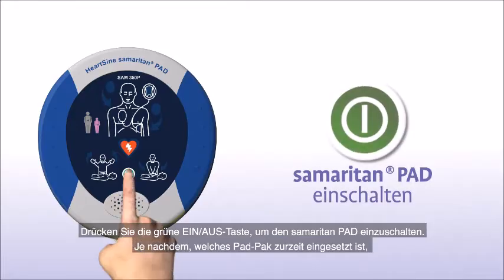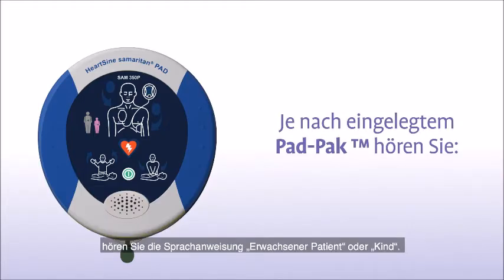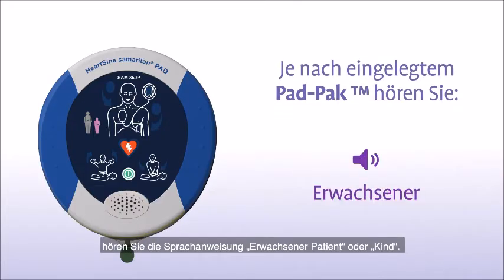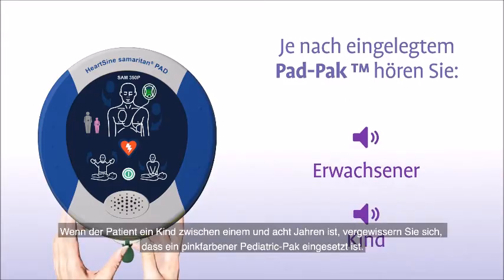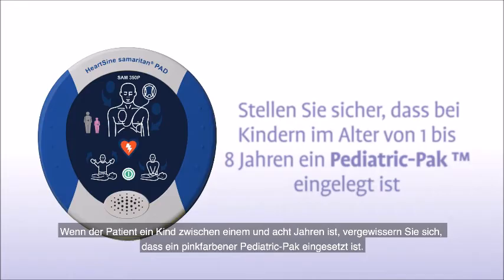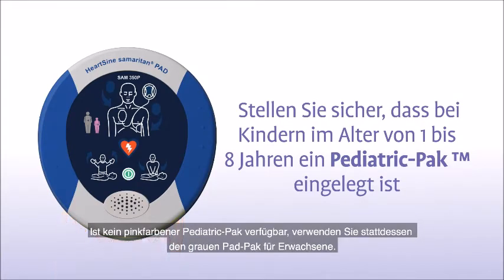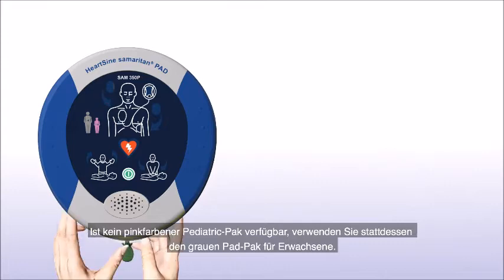Press the green ON-OFF button to turn on the Samaritan PAD. Depending on the pad pack currently installed, you will hear either an adult patient or a child patient prompt. If the patient is a child between 1 and 8 years of age, you should ensure a pink pediatric pack is installed. If a pink pediatric pack is not available, you may use the grey adult pad pack instead.